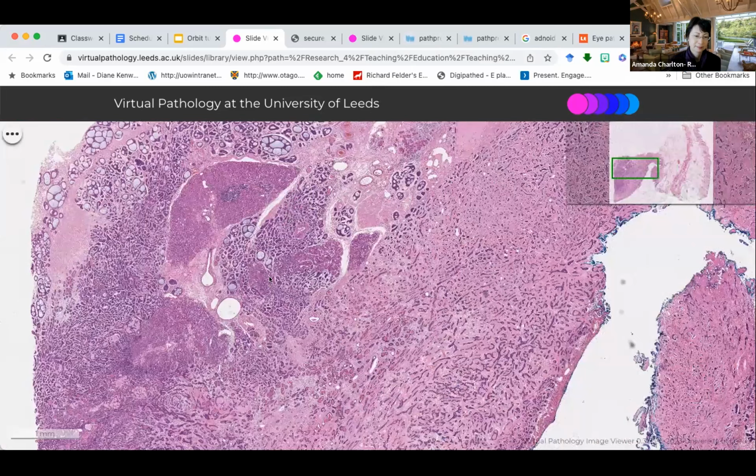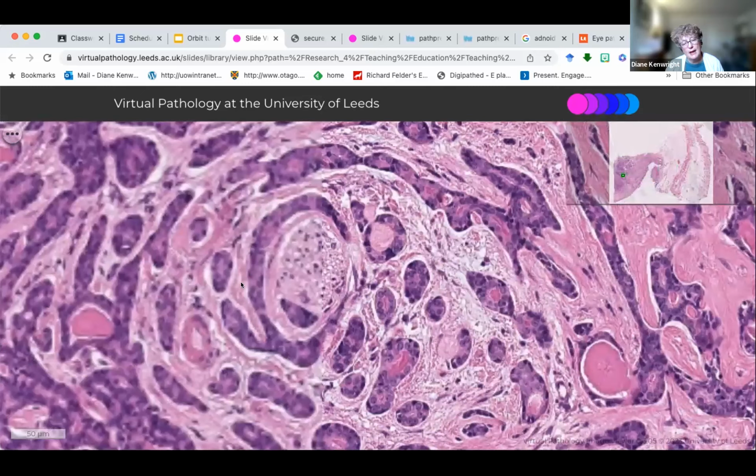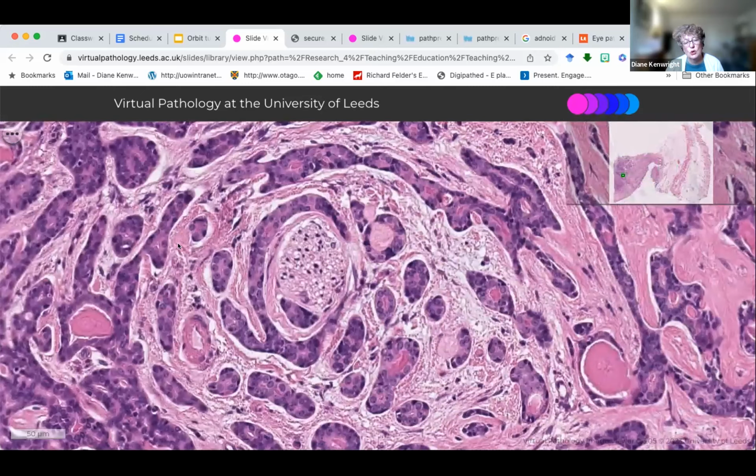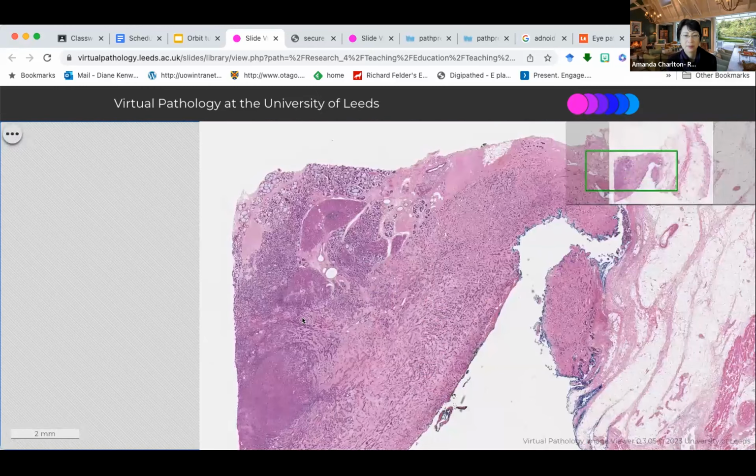And when you think you've got it out, you find nerves. So here's some perineural invasion. I spotted it at low power because I looked for the concentric whorl, right? And in the middle of it was a nerve, and this is the perineural invasion. And those cells will creep a long way away. And in 20 years, there'll be a recurrence somewhere in the neck. I can see that concentric whorl really well at that power.